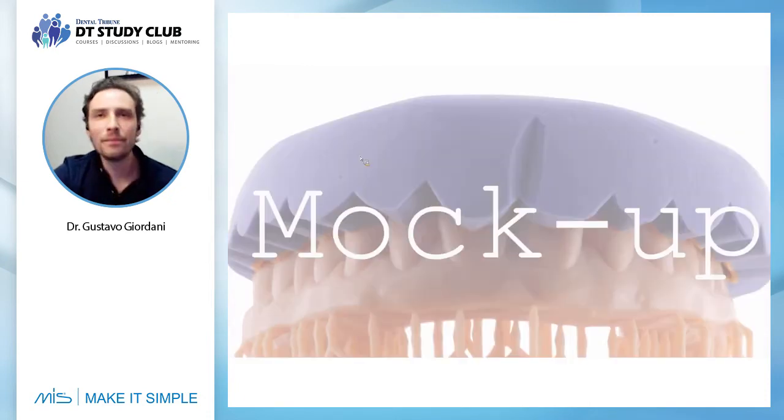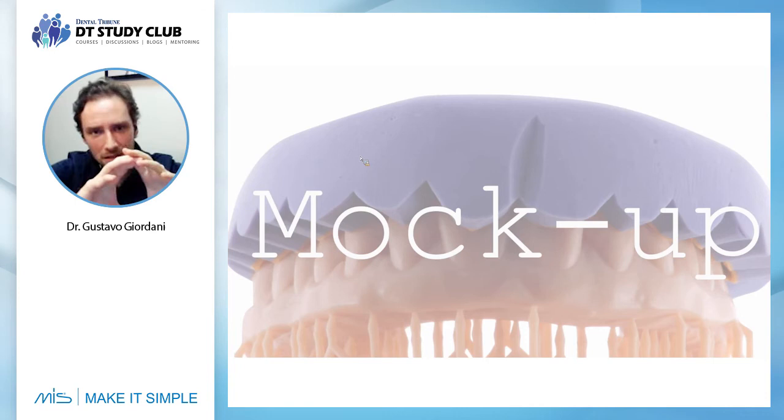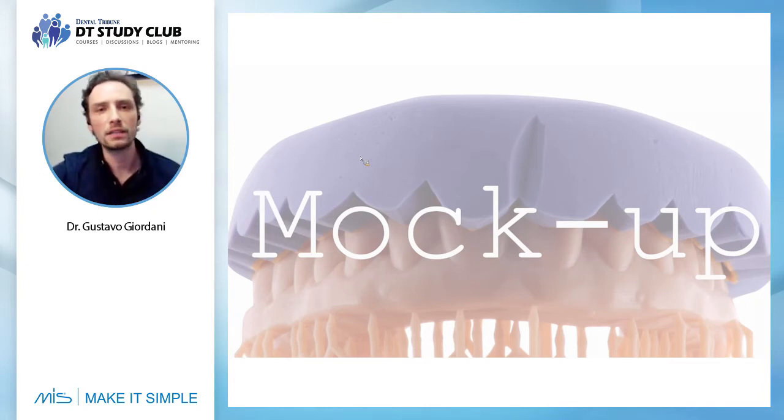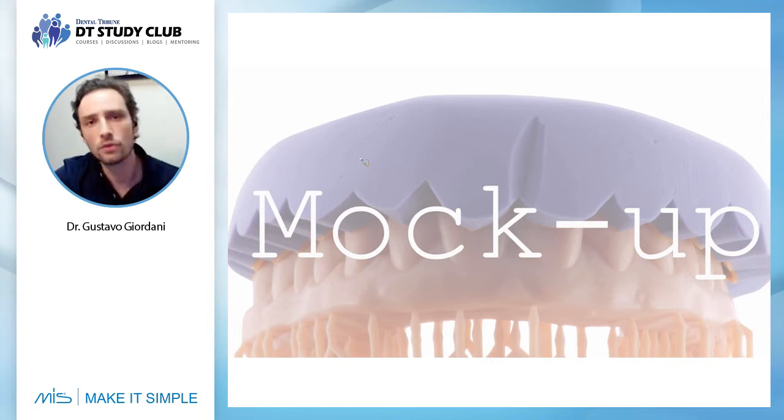So now it's time to select the shape for our patients, because the patient came for us to do aesthetic rehabilitation. So now I need to select the smile, I need to select the shapes, the teeth format, so I can plan the implant according with this rehabilitation, according with the final shapes. So now it's time to do a mock-up. Now it's time to test the new smile of my patient, and the patient needs to say yes for this new smile. Then I start to plan the implant position according with this new shape. So I need to do now my mock-up.